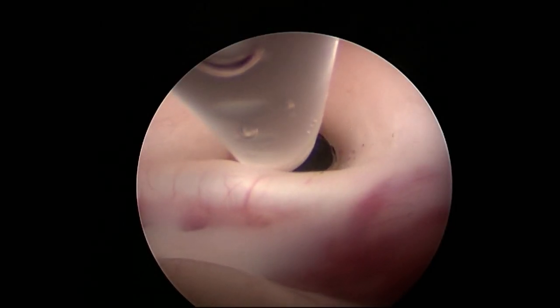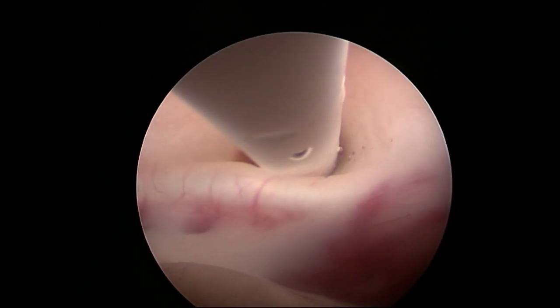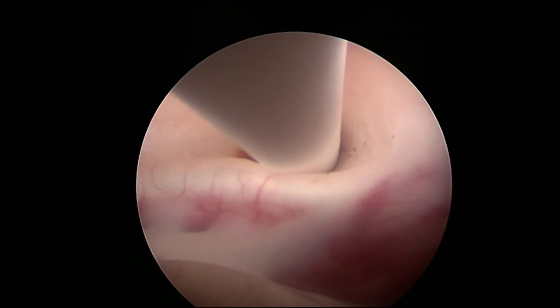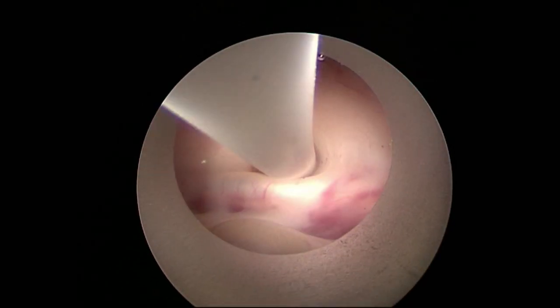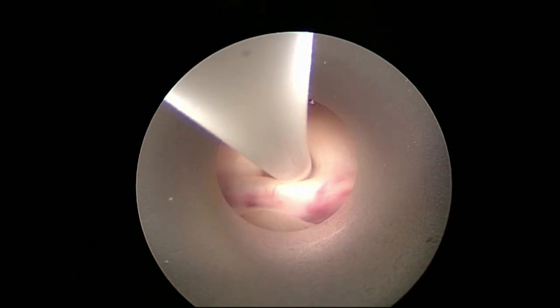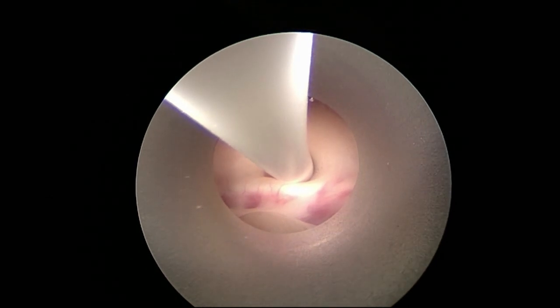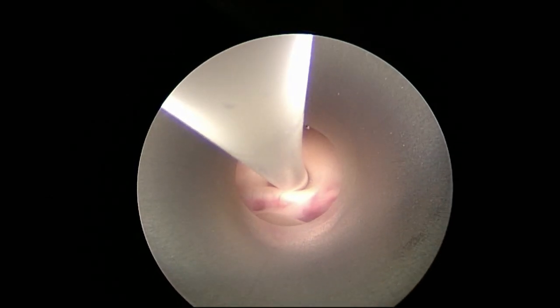The stent is then inserted into the aqueduct via the large working channel of the ventricle scope. The stent has numerous lateral holes in order to ensure communication of all the ventricles.